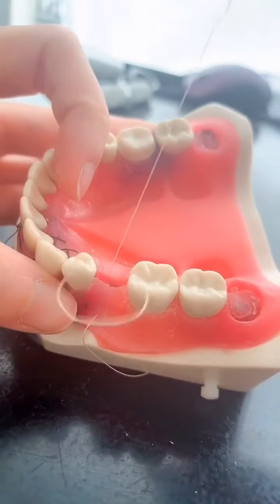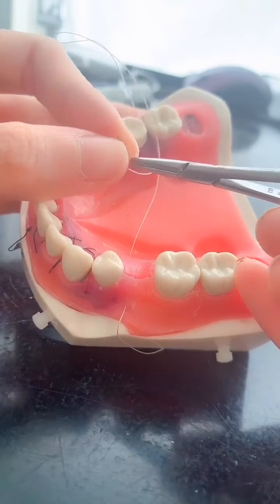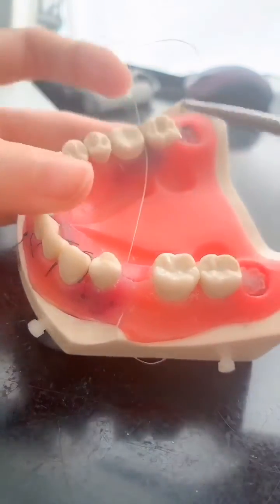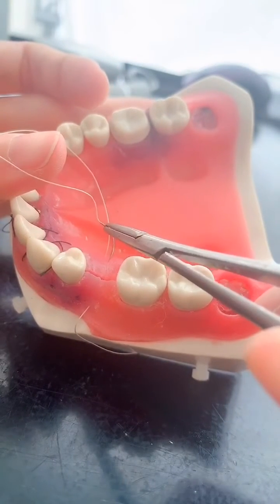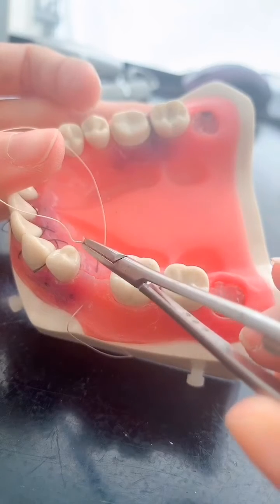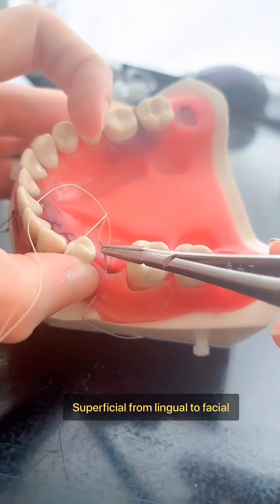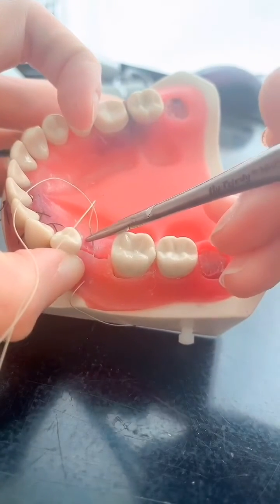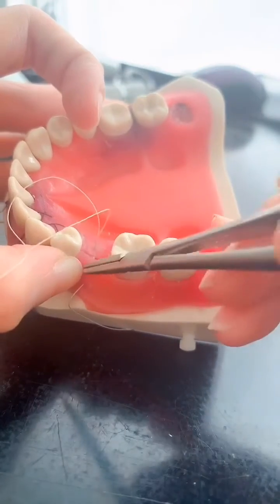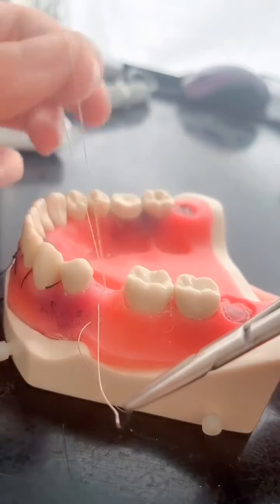Like so, and then very easy — you just trace where you're coming from except you go more superficial. So this is my deep incision, so now I'm going to go more superficial like this, and also superficial from lingual to facial.